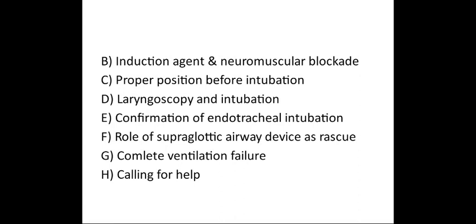Next, we will see laryngoscopy and intubation. Nasal oxygenation using oxygen flow at 15 liters per minute is given to maintain oxygenation during apnea. Repeated attempts of laryngoscopy should be minimum. It can increase risk of cannot ventilate situation because of airway trauma. We can use video laryngoscopy or conventional laryngoscopy. Then optimal external laryngeal manipulations are applied. A gum elastic bougie can be used.